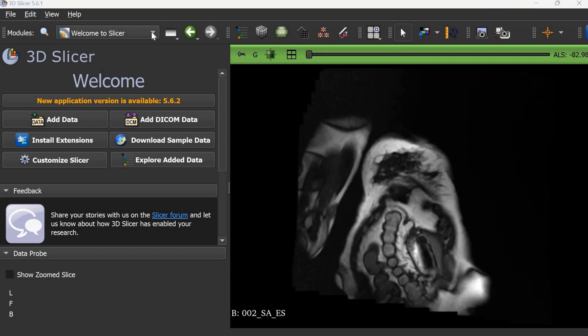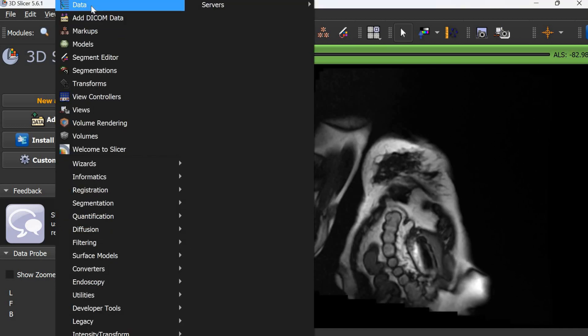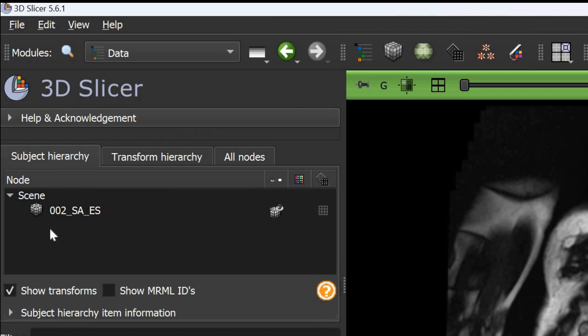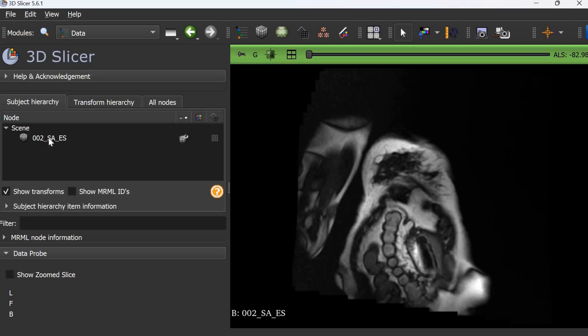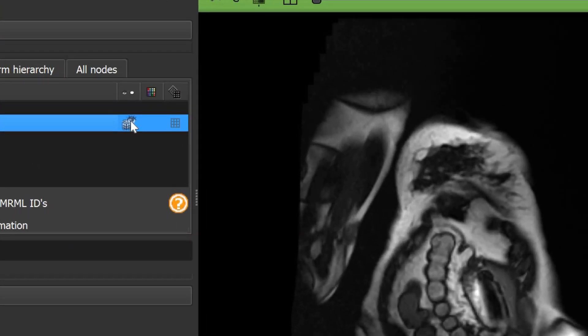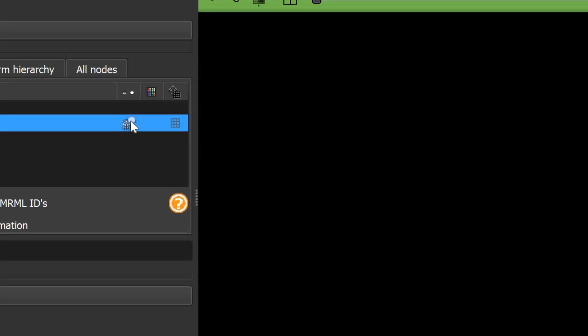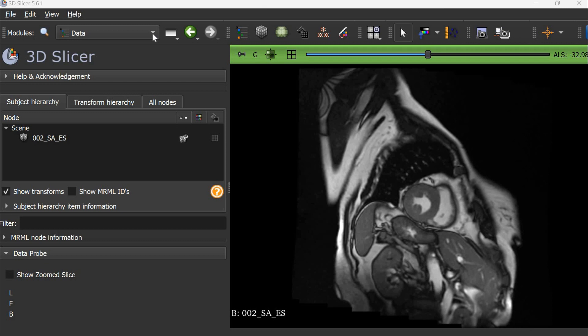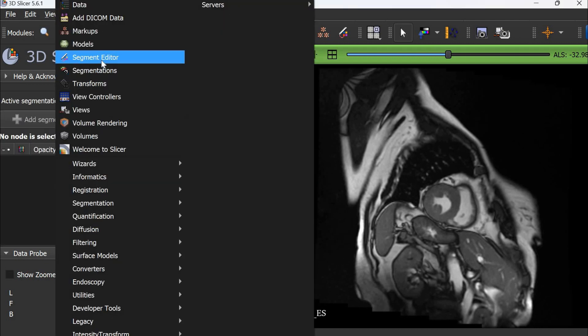Now we can change to the data mode. We can see our image data is present but no masks are there. To create masks, we go to the segment editor.